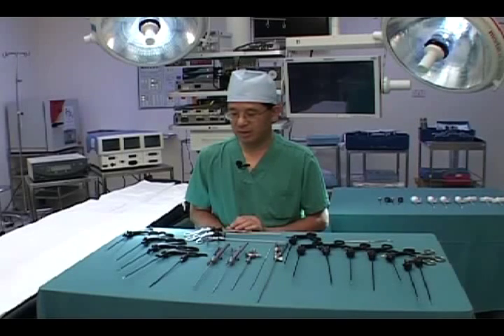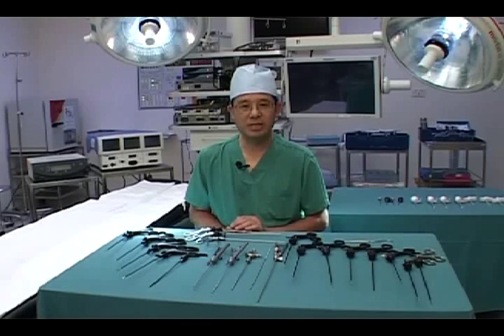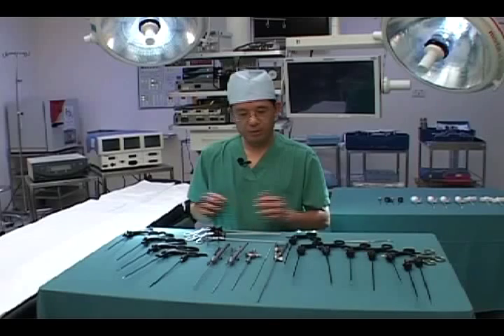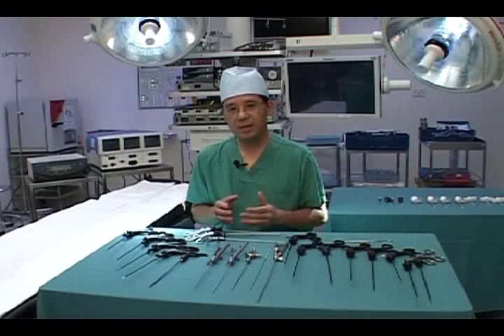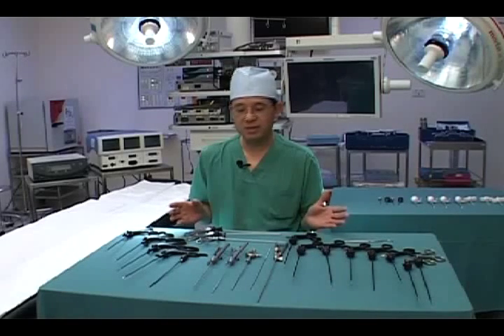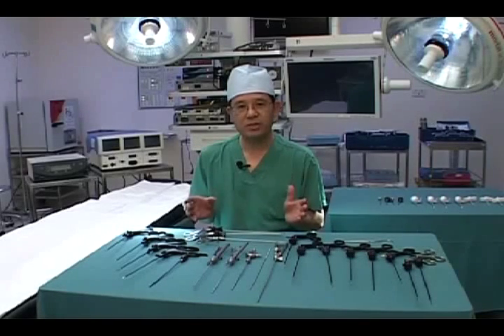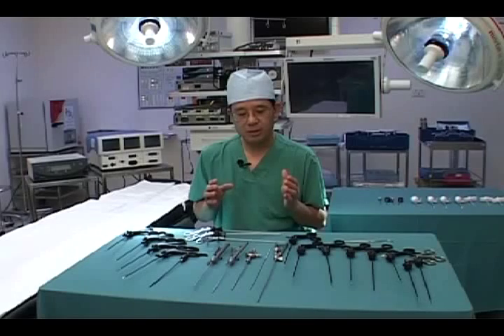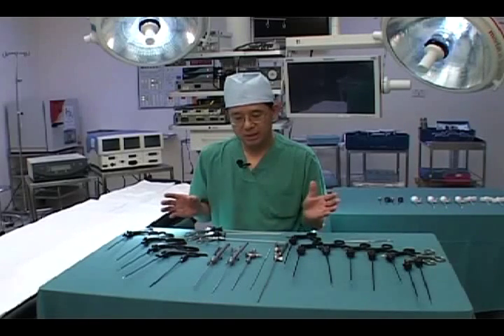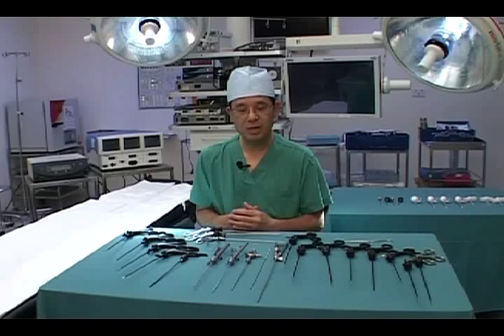My brief today is to talk about some basic laparoscopic instrument setup that I routinely use for all common pediatric laparoscopic surgical operations. Essentially what you see here is the set that I've been using regularly for the past over 15 years, basically without much change. They are time tested and very versatile, and if you are really good in using them, this can take you through basically all types of laparoscopic surgery in infants and children.